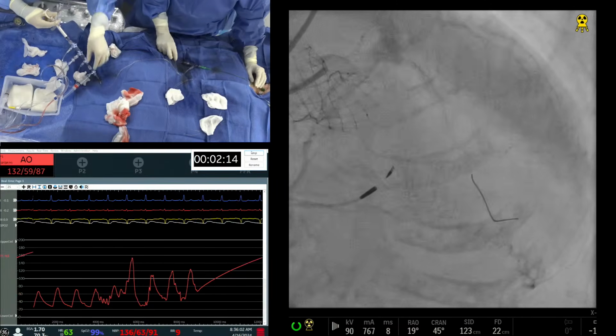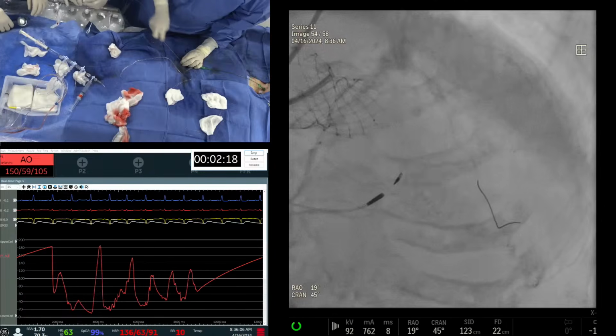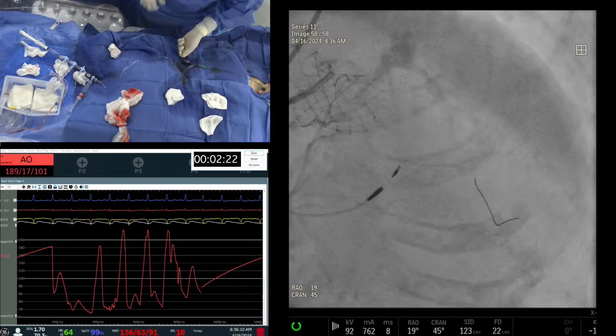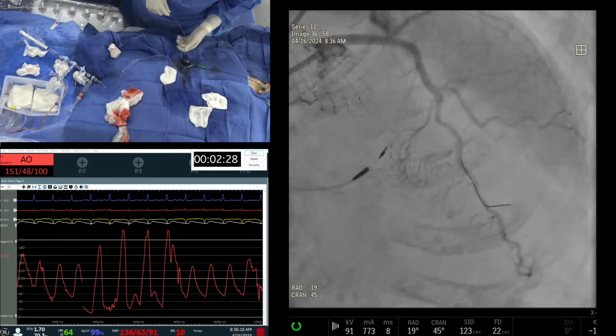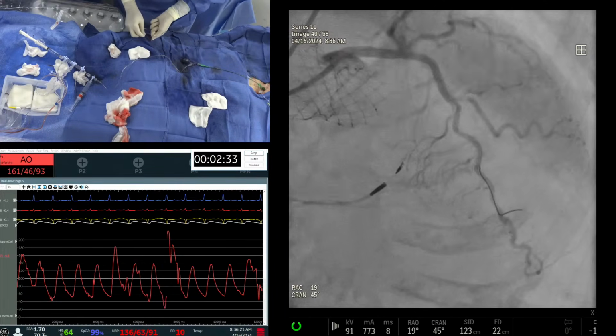Yeah, just looks beautiful. Area need to do a little. 12? Yeah, 12. We had 3.25, 12. Okay, you want to show anything in addition, take this wire out. No, do we have the one where we use a guide liner and we do the PCI? I mean, we've shown how to do PCI. The animation with using the guide liner, Andrew?